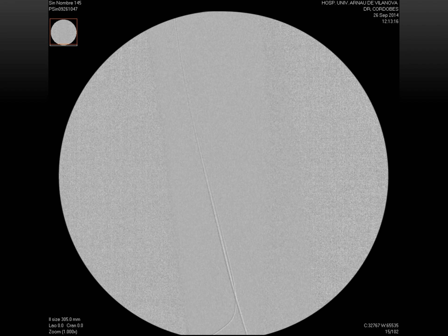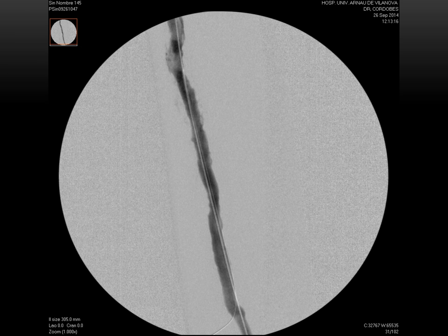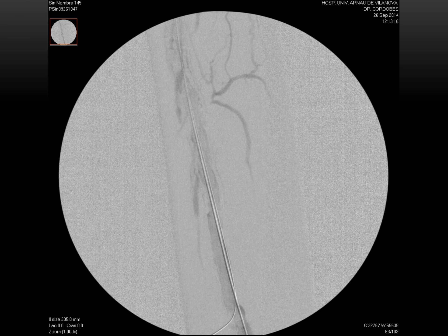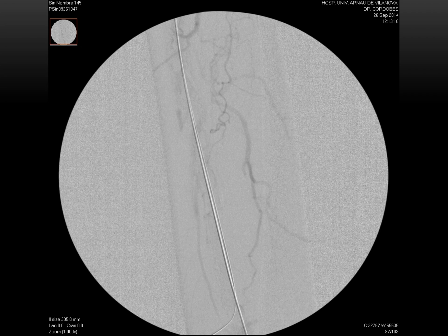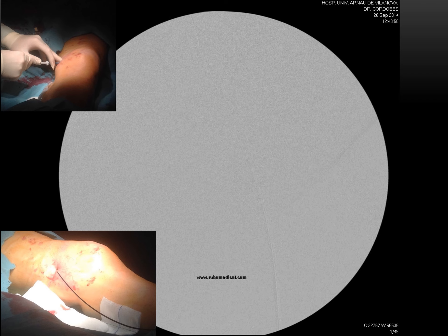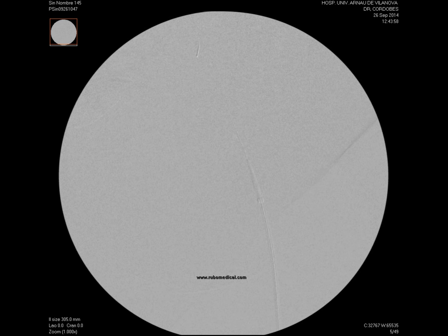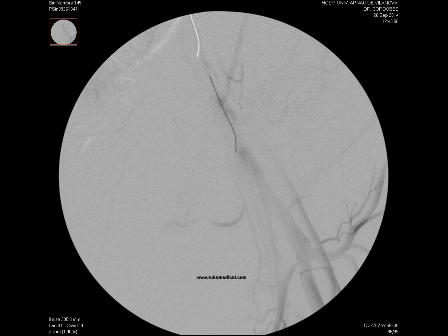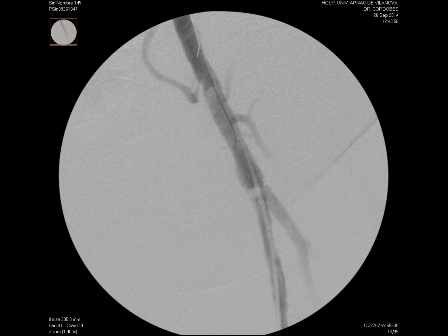Here we can see the double wire — one from the antegrade approach and the 0.018 wire from the retrograde approach. Trying to minimize trauma to the artery, we passed the dilator of the five-French sheath to allow passage of the stent through the skin and its entry into the artery from the retrograde puncture. In this angiography we can see how we position the stent at the origin of the superficial femoral artery, achieving a very precise release.